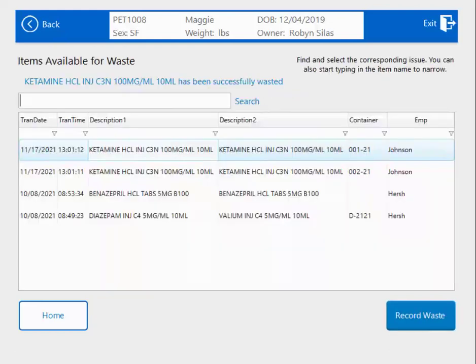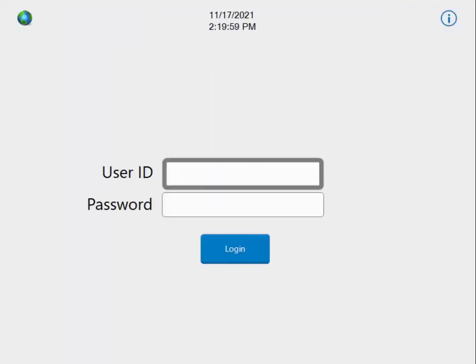I hit Next, and now I can either hit Home to do other things in Cubex, or I can hit Exit.